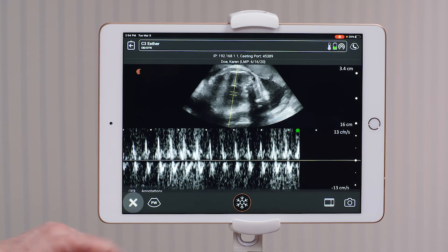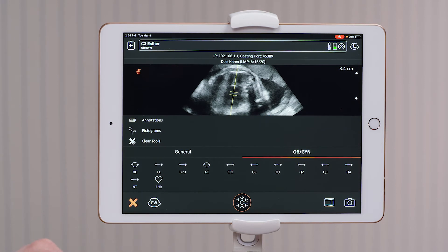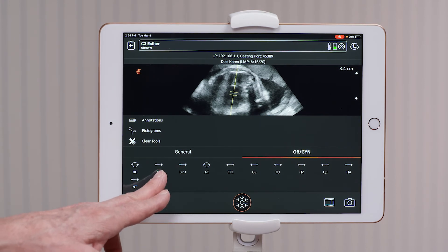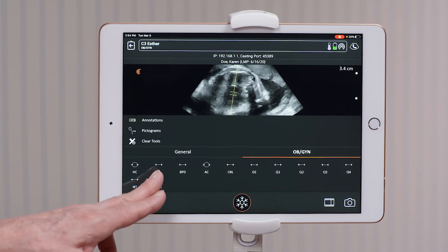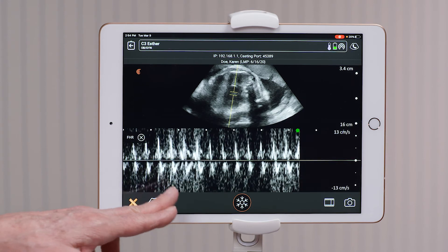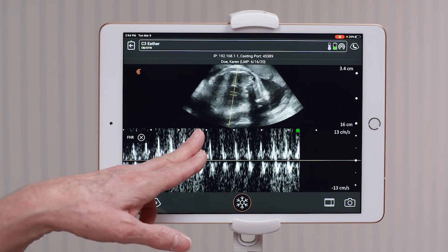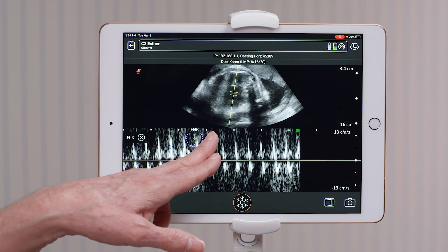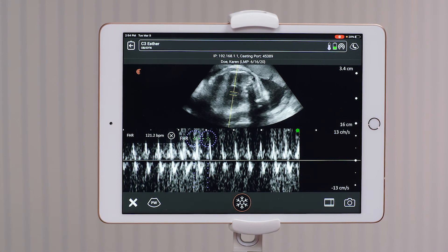Go to your measurement tools on the bottom left-hand side, select fetal heart rate, and measure from peak to peak for your fetal heart rate.